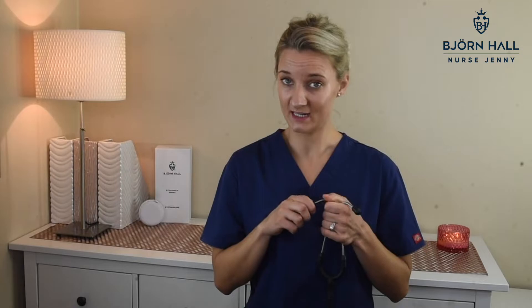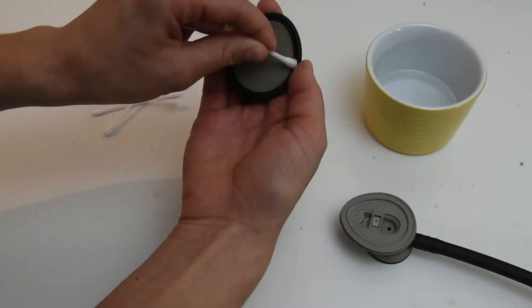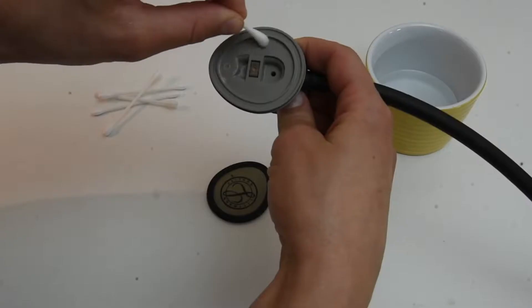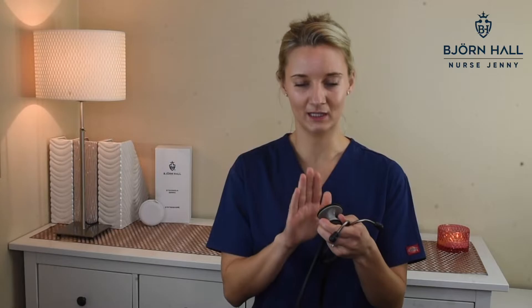Then I would go to the diaphragm. Take the diaphragm off. Again, I would use a Q-tip or cotton tip, dip it in some alcohol, and clean around all the crevices in the diaphragm and also on the chest piece. I would clean it thoroughly and make sure that it's dry before I put the diaphragm back on.